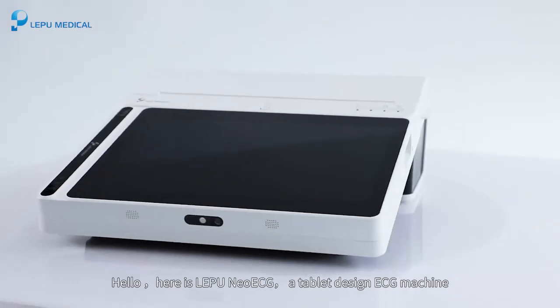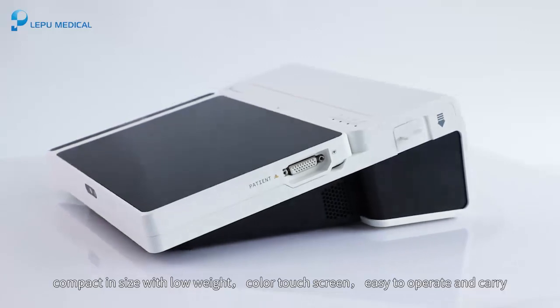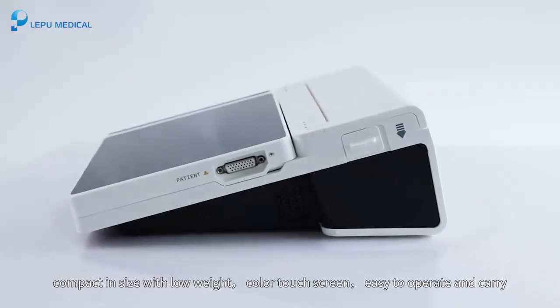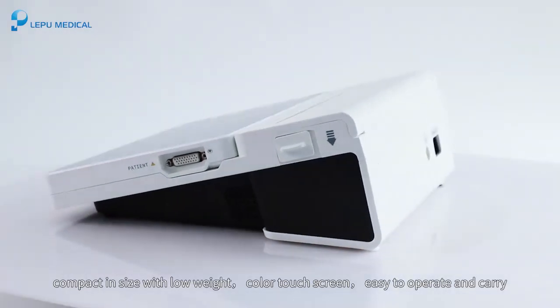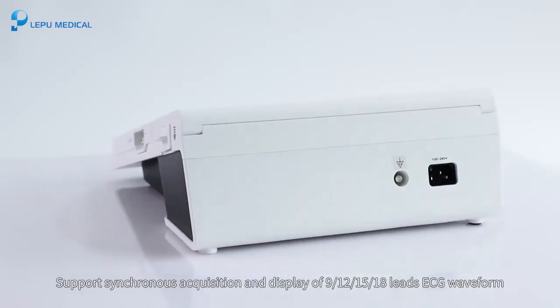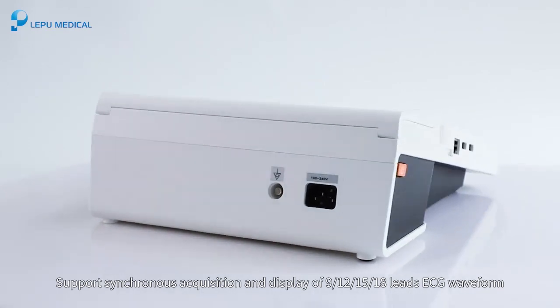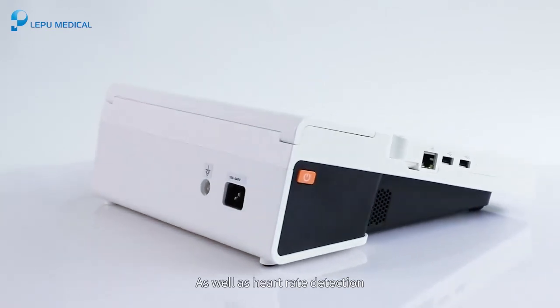Hello, here is the Lepo NEO ECG, a tablet design ECG machine, compact in size with low weight, color touch screen, easy to operate and carry. It supports synchronous acquisition and display of 9, 12, 15, and 18 leads ECG waveform, as well as heart rate detection.